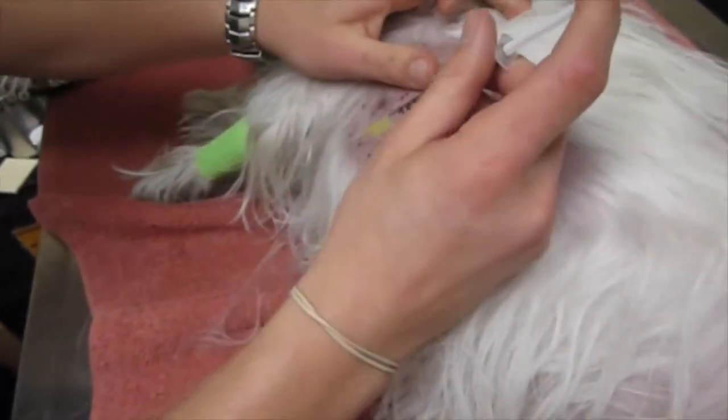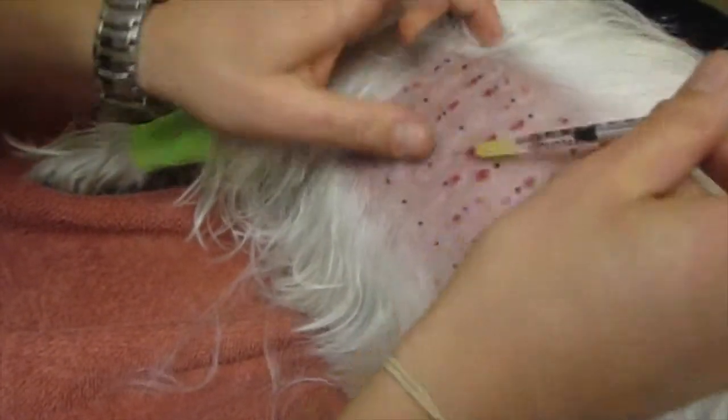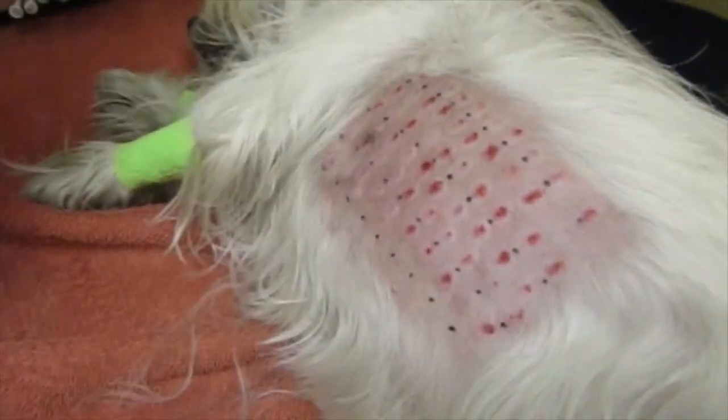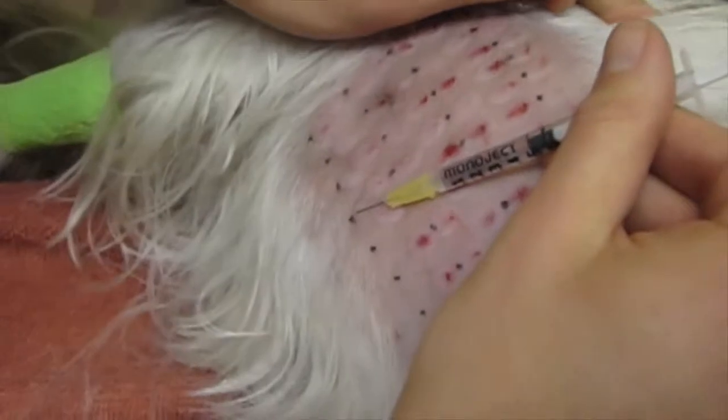Here's Willow, and we've done each of the injections — we're in the very last row. You can see Zach has done this a lot; he's very good and very fast at it. We go right into the skin and we make a bleb.